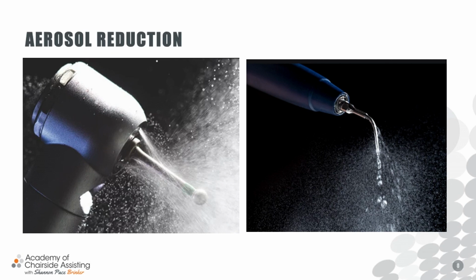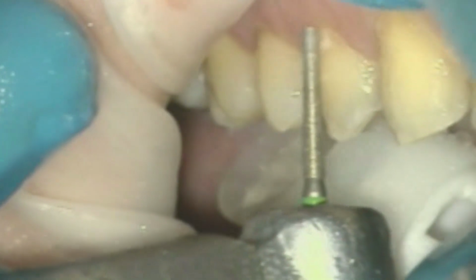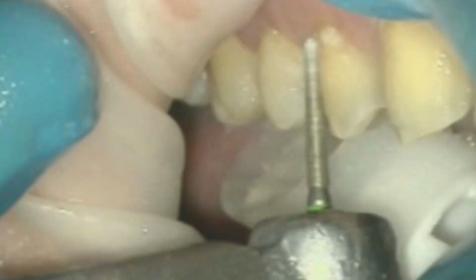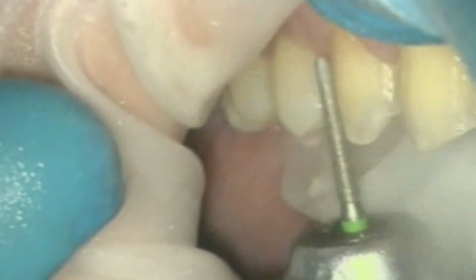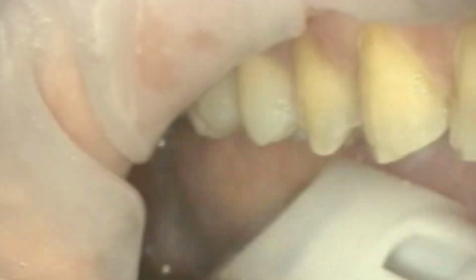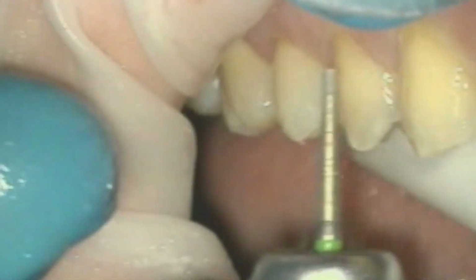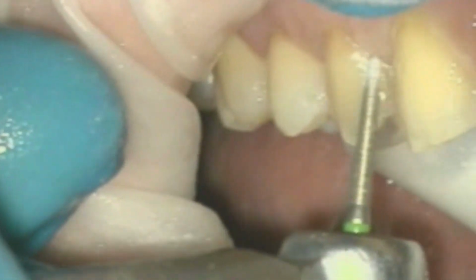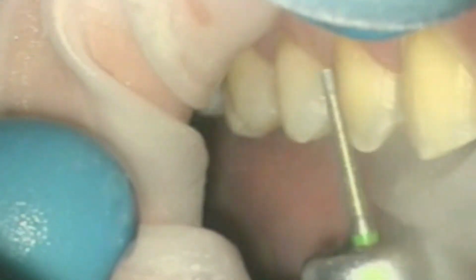We know that, and it is also noticed by the patient. But what is it that we don't see? We really want to focus on the emphasis for a suction system here. Thinking about all the years that I was assisting, my face being right in front of the handpiece all the time, and acknowledging that's not just hygienists. I mean, you think about an assistant, our head is bent and in the mouth, just like the doctor is. And a lot of times we're bent and deep in the mouth, probably because we can't see sometimes, no offense to you doctors out there.